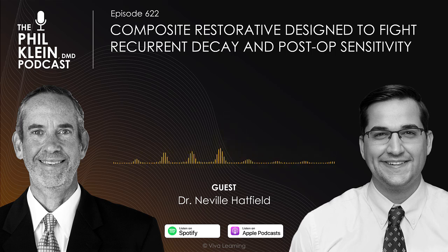Everyone's done those class 5 composites on the anteriors between 6 and 11, right? And then after like 2-3 years, you start to see the marginal breakdown of the bonding agent, and then it starts to really accumulate staining from coffee drinking or soda or bad habits that they have. And I don't really see that as much with these composite resins that contain Giomer chemistry. They just really do an awesome job with fighting recurrent decay.